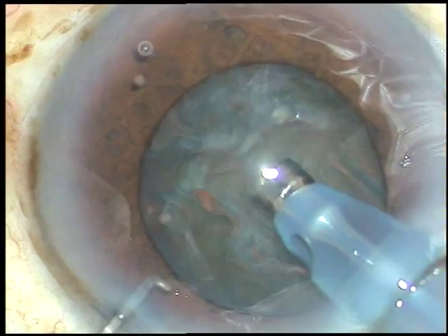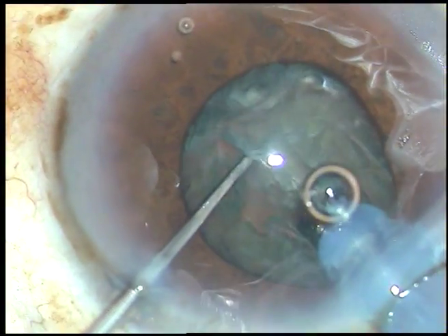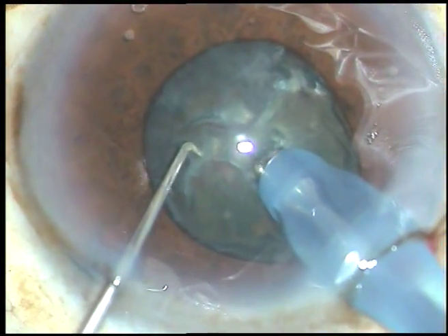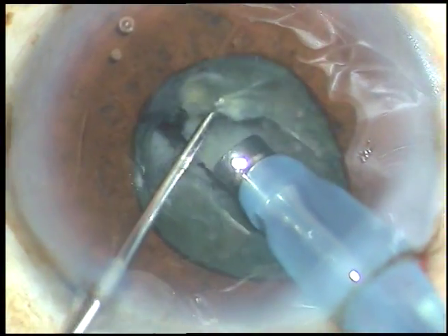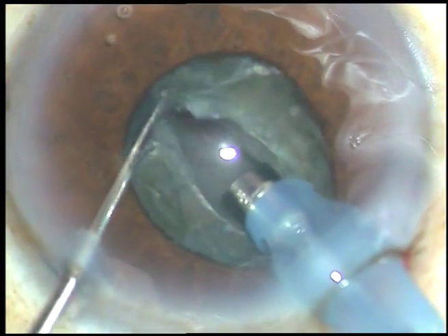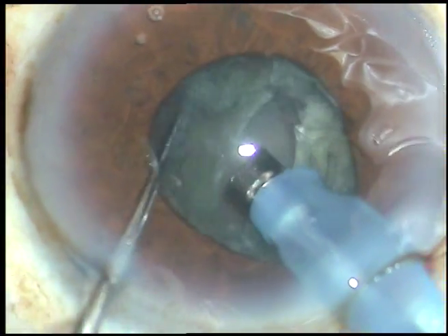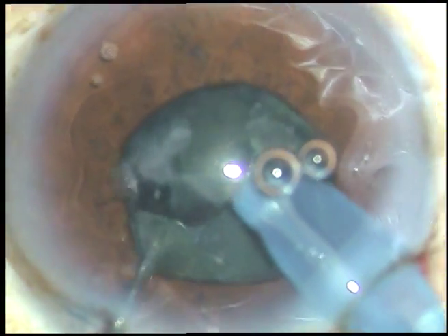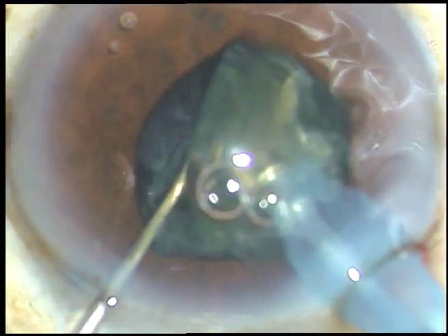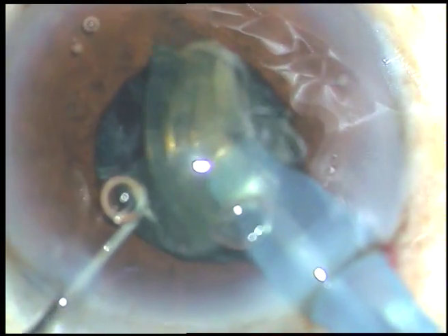What I am planning is a direct chop — pushing the nucleus down a little bit, burying the tip into the substance of the nucleus, holding the nucleus very nicely. And this is vertical chop, dividing the nucleus antero-posteriorly, which can be called vertical chop.